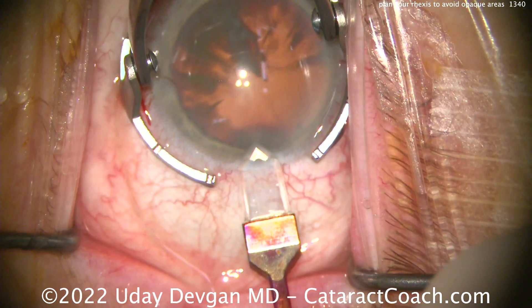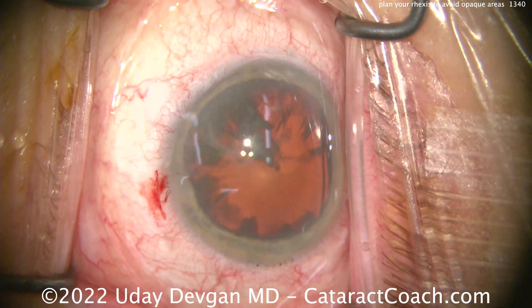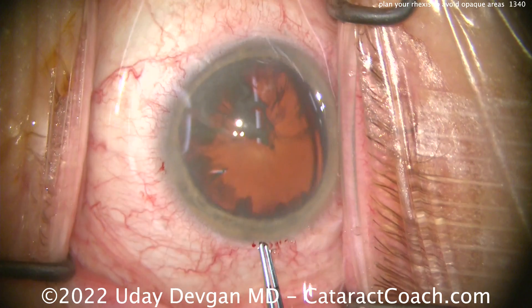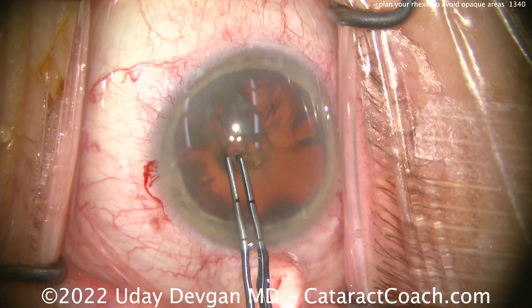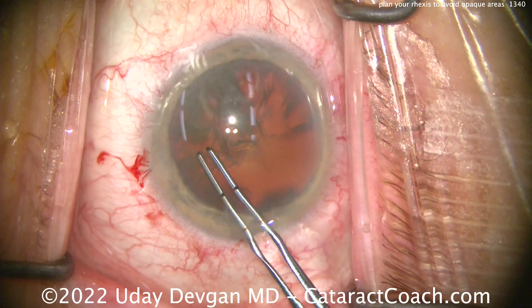Here's making the incision with the diamond keratome. Looking at those cortical opacities, they're probably every 3 o'clock hours or so, so you should have a nice window where we still have a good red reflex. Measuring out 5 mm, we're going to poke in here in the center, and I want to not go in that area where it's totally opaque, so I'll start here.